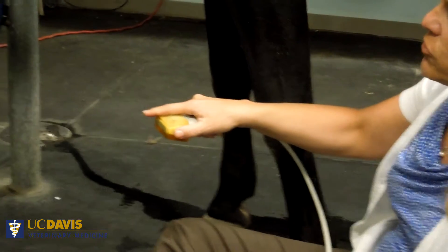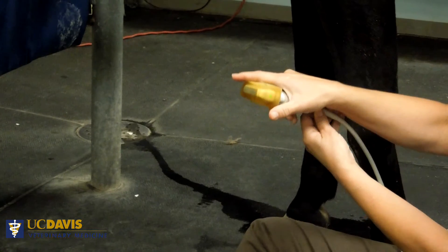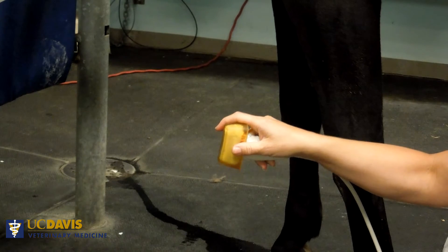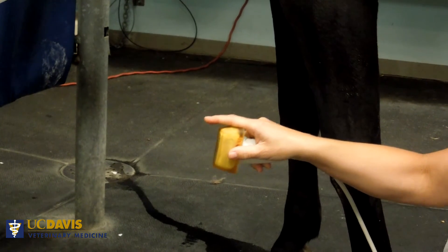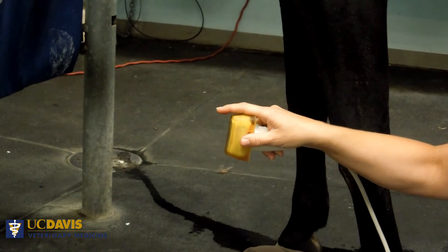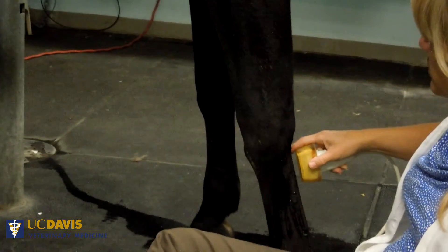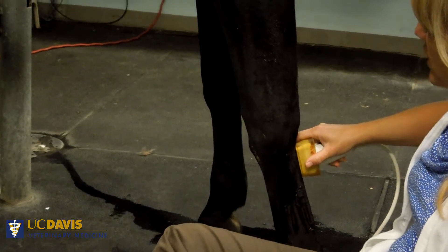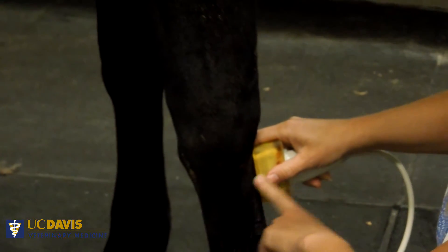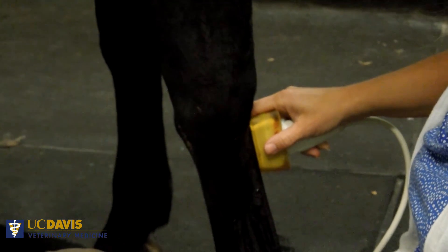When I go to do a longitudinal view, I'm going to keep my hand in space the same. I'm going to rotate the transducer so that my thumb is again on the lateral aspect of the transducer, and my index finger extends out. That index finger is key to really help stabilize my hand so that I don't fall off of the structures that I'm scanning. My thumb is not necessarily touching the horse — that's okay — it's just laying on the side of the standoff.